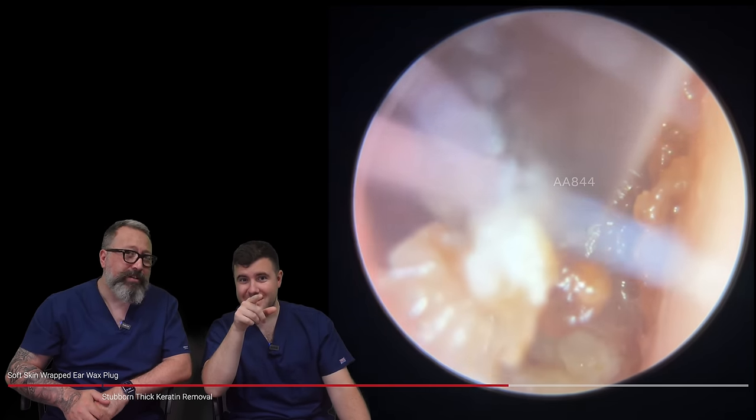Here we go — you can see the features of the drum there. Look how deep that retraction is. I wouldn't have wanted to risk getting anything more away — I've taken away as much as I safely can. I've referred this patient back to the GP, and I hope they can get this looked at by ENT. That was a really really difficult one. I wasn't expecting it — when the lady first came in I was just expecting a nice easy soft little bit of wax. But as soon as I started I thought, this is going to be a long one.